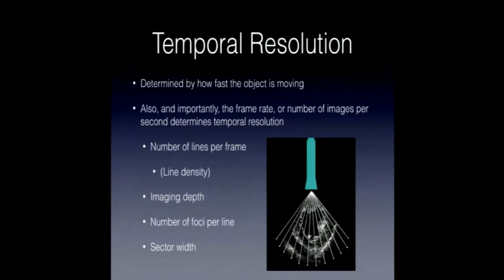the scan lines. And so if you have a lot of scan lines, I used to think when I started using ultrasounds a lot during my fellowship that we should get a faster machine. We'll be able to get a faster frame rate, but it's not necessarily the faster processor that's the issue. It's the listening time is so great. As I mentioned earlier, there's a pulse, and then we listen for a long time, and then we have to send out another pulse, and we listen. And it has to do it along each scan line, and also to each imaging depth or foci along the scan line. So it's not just a limitation of processing power; it's actually physics and listening time.